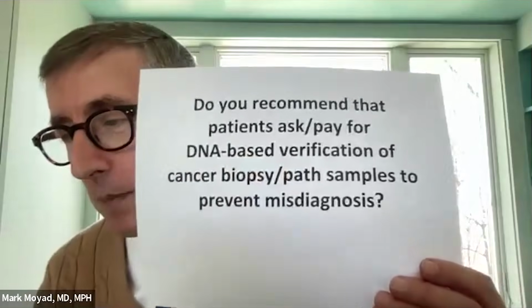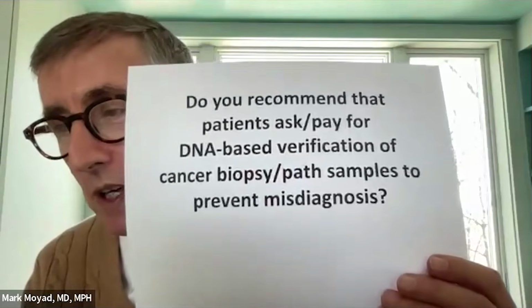So the slides they're seeing or you're seeing are clearly that person, that has been matched up, say, with a buccal swab. I've seen some of your reports. You have some DNA-based verification that's done, or some people have done. Is that something you recommend, or you're not sure yet, to match the patient up with their actual slides? What are your thoughts on that?